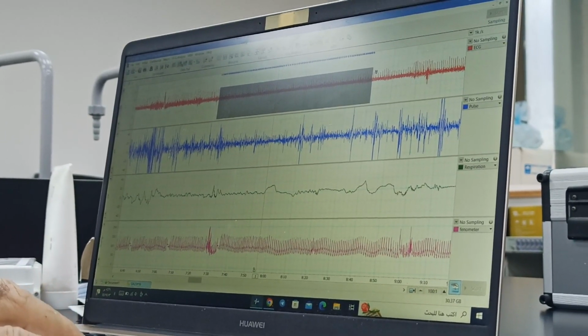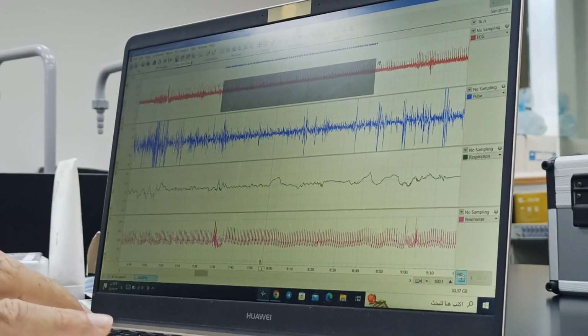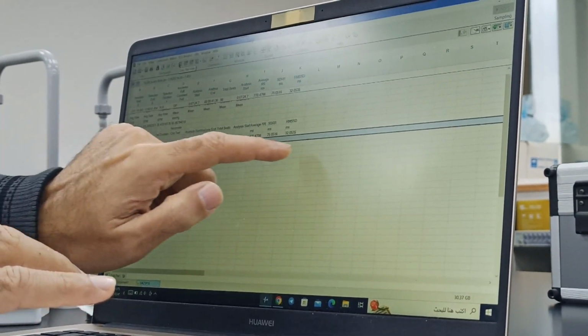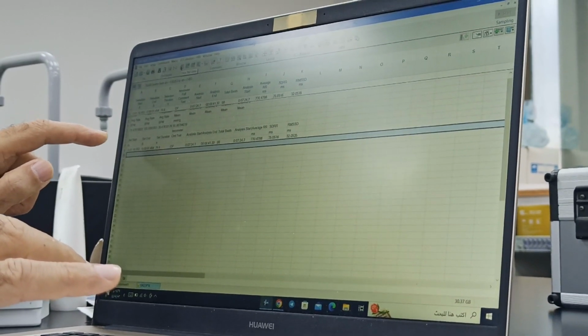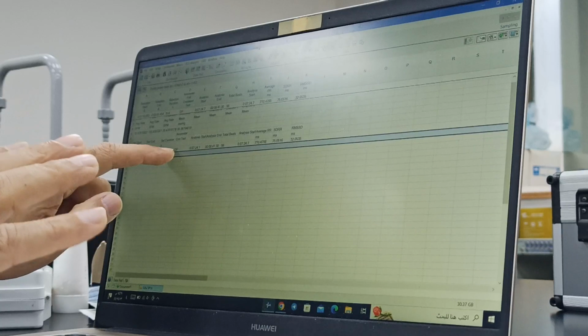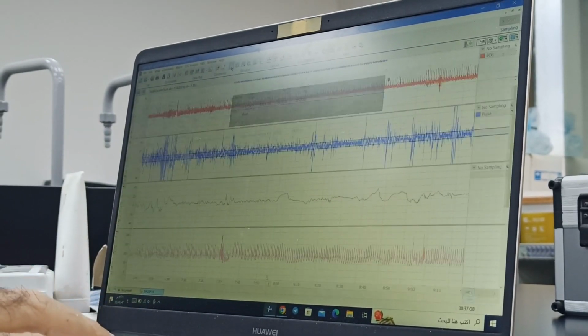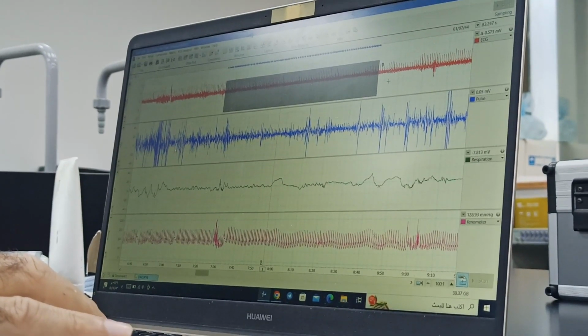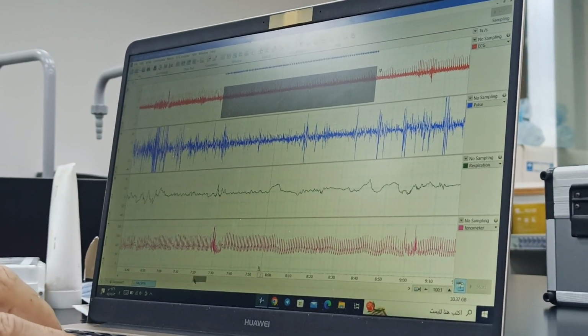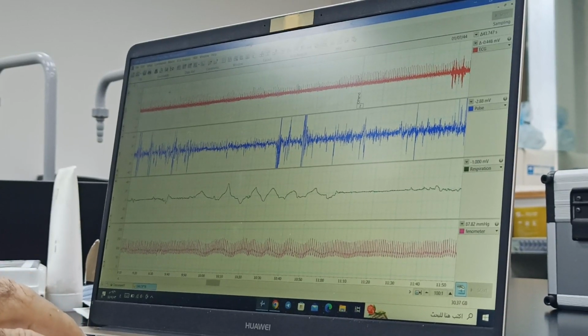So we go back here, and now we say add data. Go back. So this is added. Comment also coming, D, P, deep breathing. It should have been B, not P. Now you go to the next area probably. So this is again normal breathing.